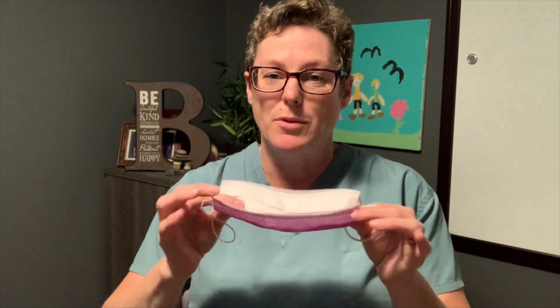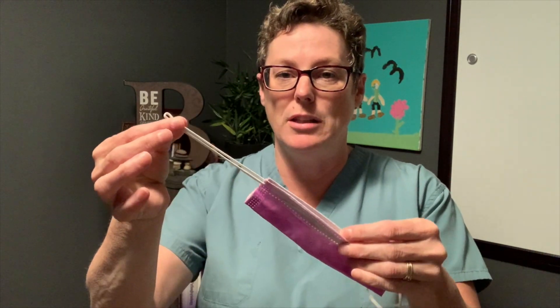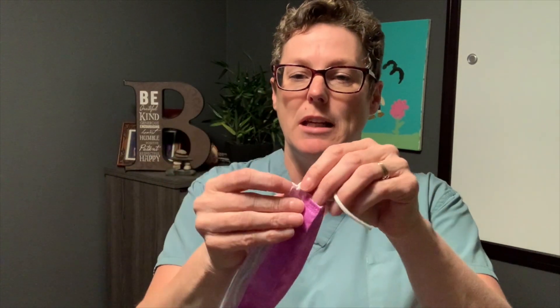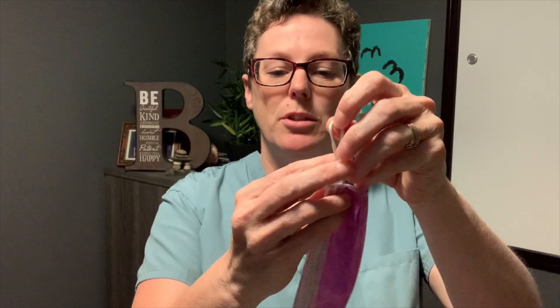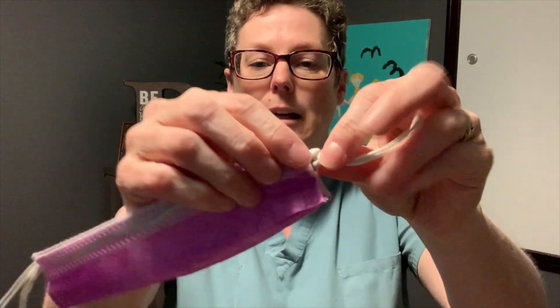Starting with your surgical mask, what we're simply going to do is fold it in half, and then we're going to take the ends here — this is using the ones with the elastic ties. We're going to take the ties and create a knot, and we want that knot to be as close to the mask as possible.